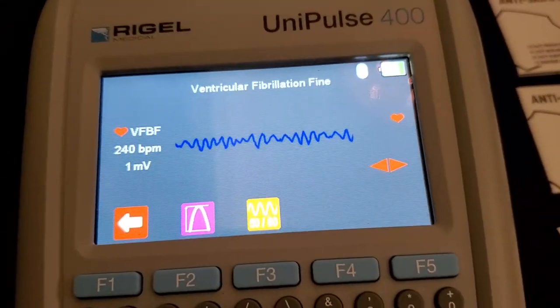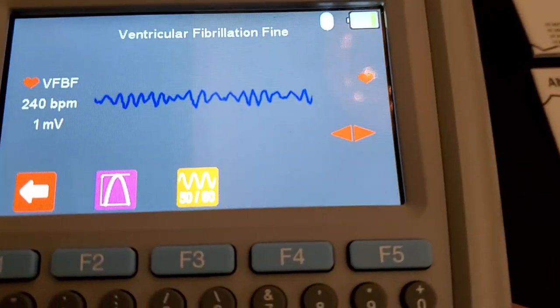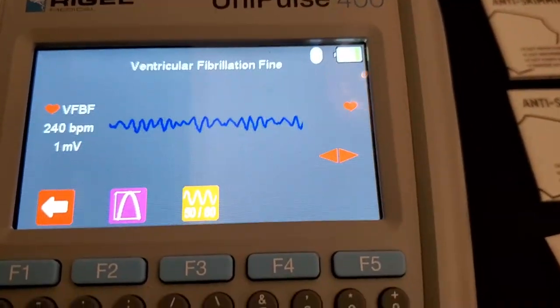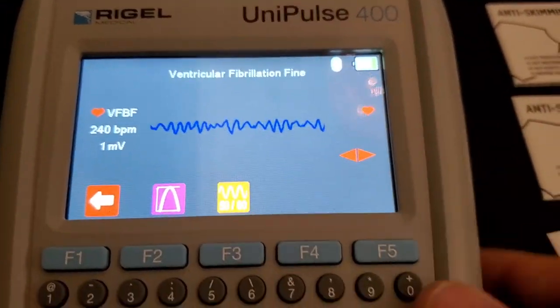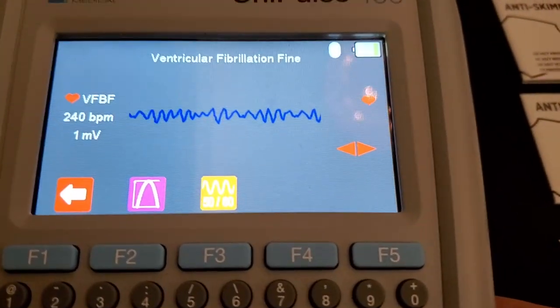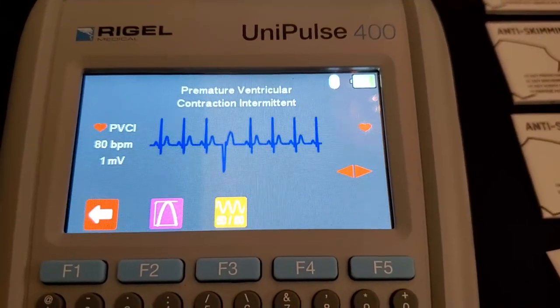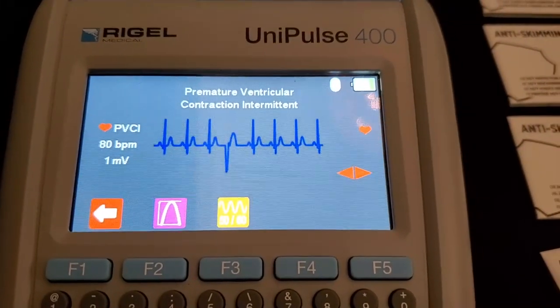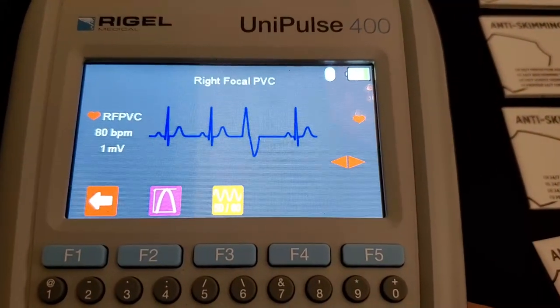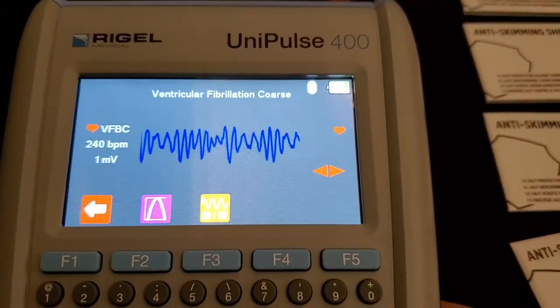So this could not only be just a training aid, but you know exactly what you should be seeing on your ECG. So if you have analytical ECG, you can actually verify what the analytical ECG thinks the arrhythmia is — kind of a cool thing. So I'm going to flip through some of them: premature ventricular contraction, bigeminy, trigeminy, PVCs. That's very cool.